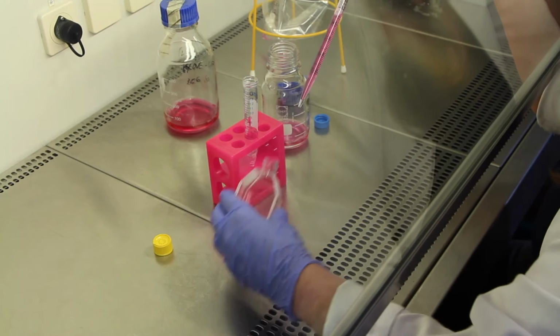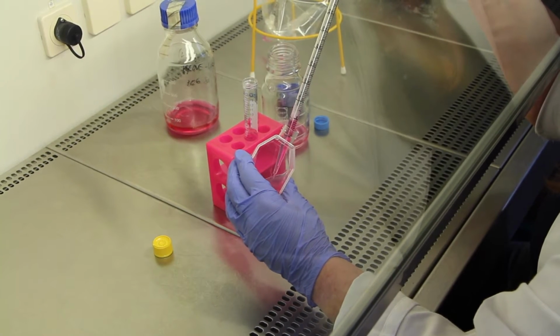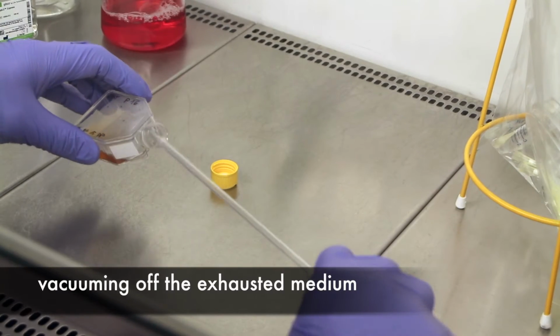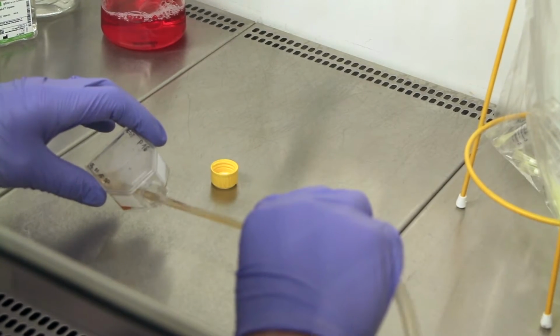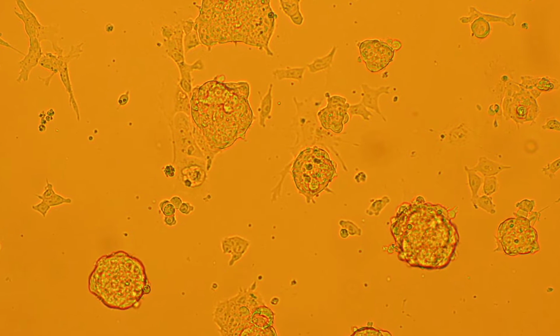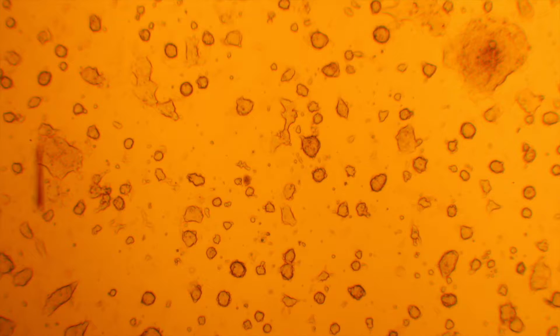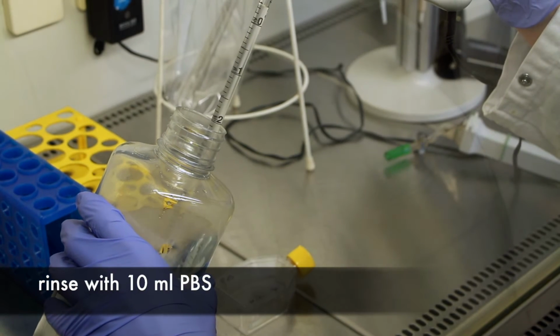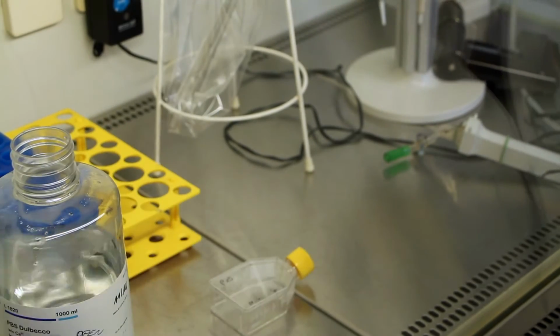The culture flask is incubated for 24 hours at 37 degrees Celsius and 5% carbon dioxide, followed by a further change of culture medium. After a further 24 hours, the cells are passaged. To this end, the exhausted medium is first vacuumed off. As the cells adhere to the bottom of the culture flask, they stay in the bottle. Dead cells are rinsed off with 10 ml of PBS.